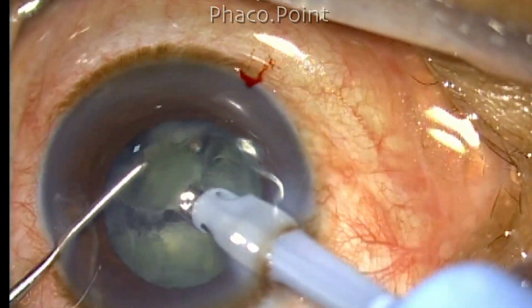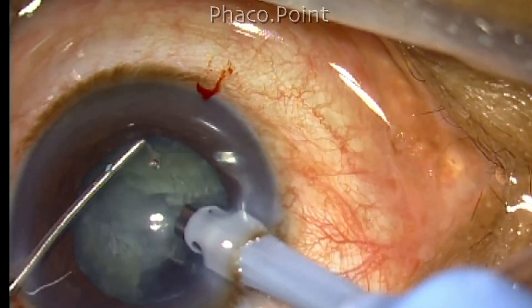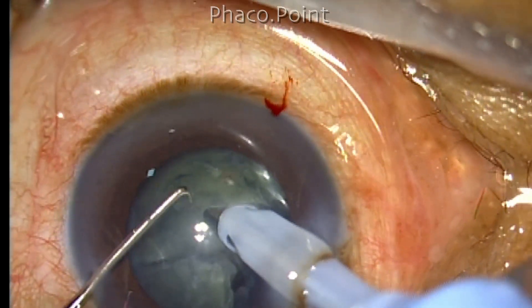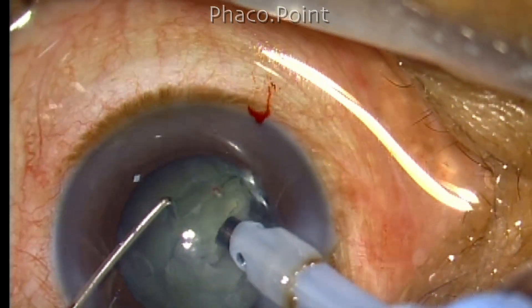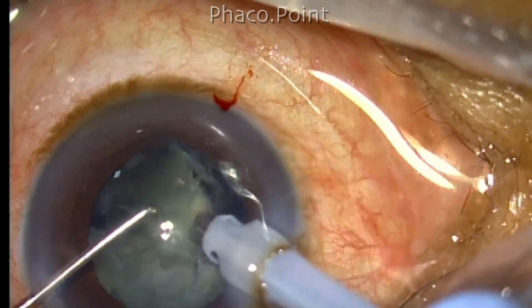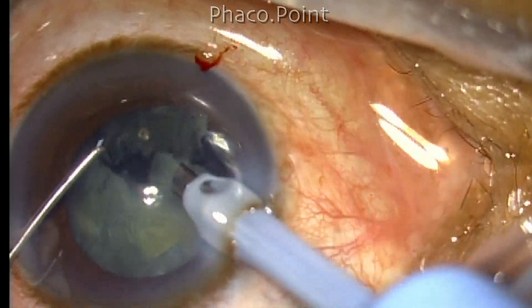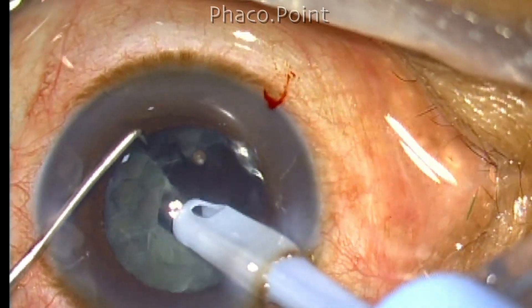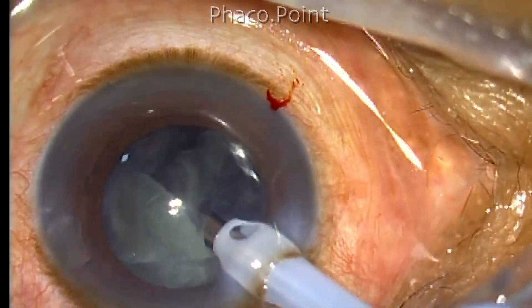However, do not get put off by the fact that the nucleus does not rotate. You can continue with phaco emulsification — do an in-situ chop. The fluid wave that comes out from the irrigating ports of the phaco handpiece will pass between the cortex and the posterior capsule and create a hydrodissection wave. By the time you are down to cracking two or three nuclear fragments, you will find to your surprise that the entire nucleus-epinucleus complex is quite freely rotating, because of the high flow of the irrigation-aspiration fluid system.